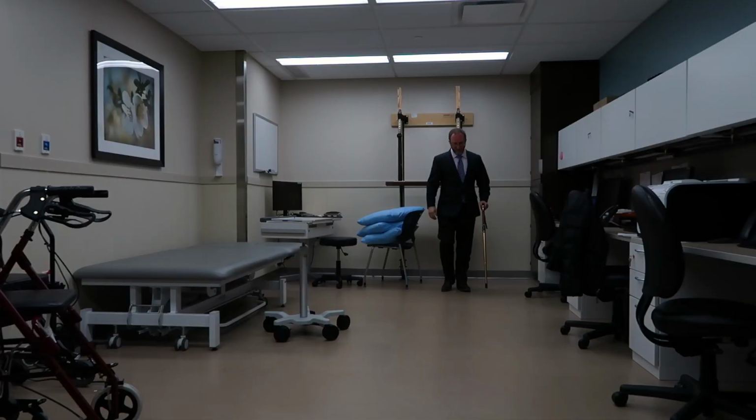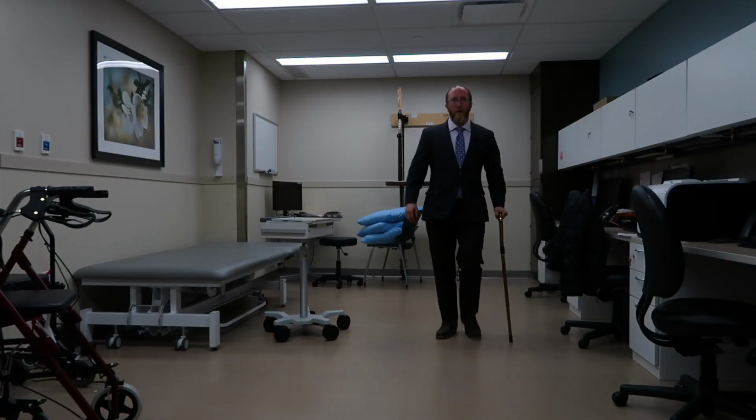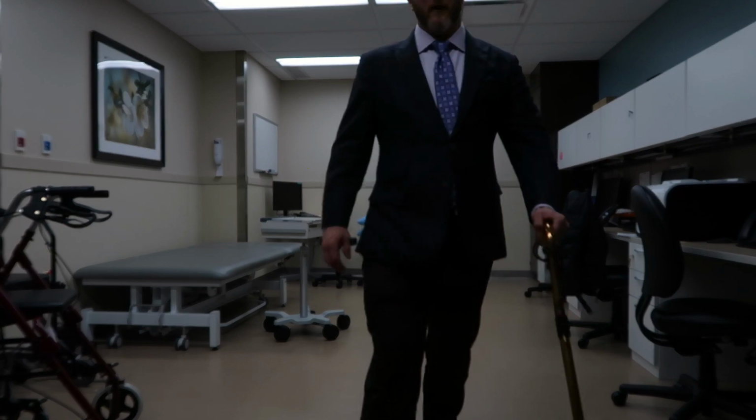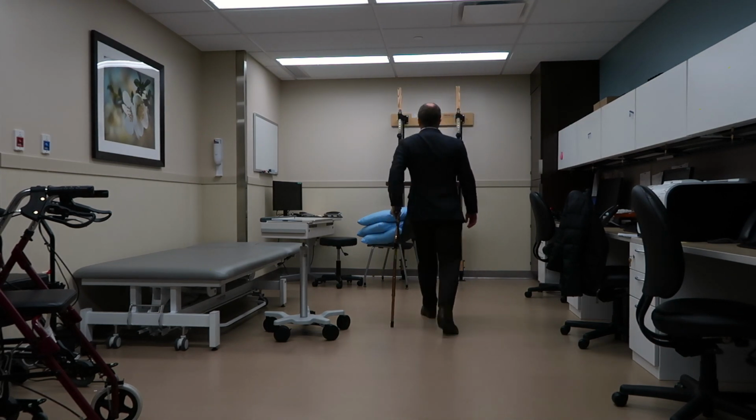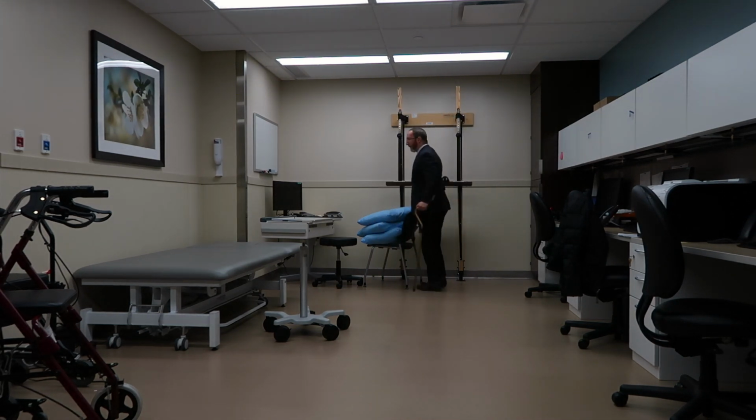So then I take a step forward. So if I show you what that looks like from back here, I'm going to take a step forward with my bad leg and my cane, and then I'm going to take a step forward with my good leg. I'm going to put this forward, and then I'm going to walk like this.